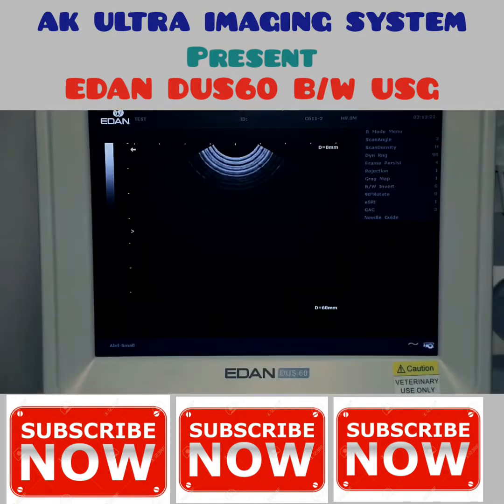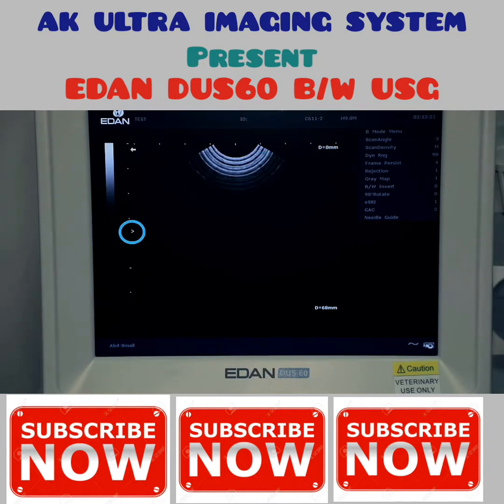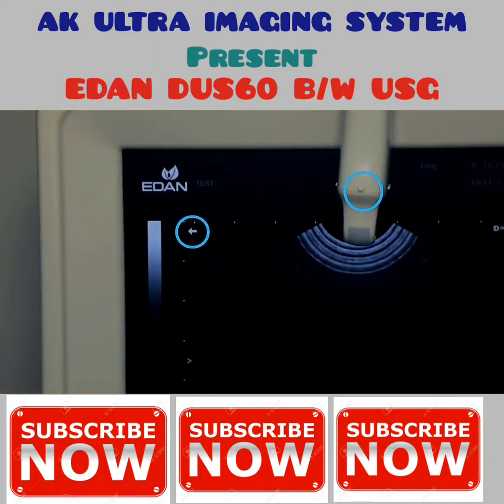The screen is also divided into sections: menu, image, display, coordinate axis, focal point position, and probe indicator. The probe indicator corresponds to the position of the probe mark.